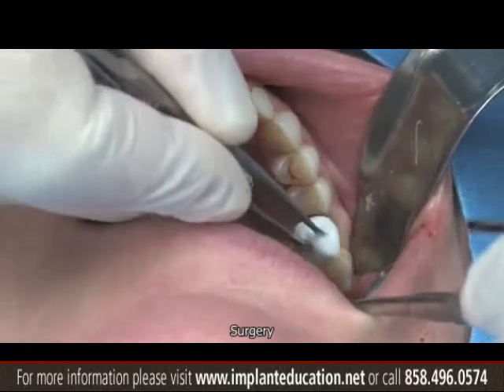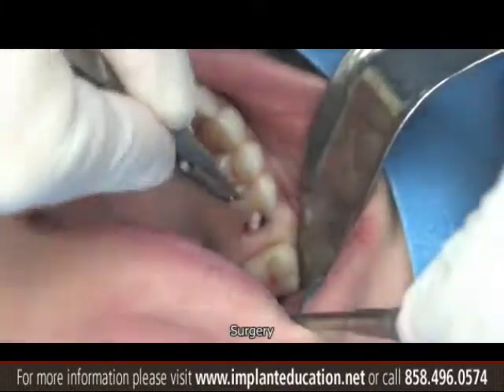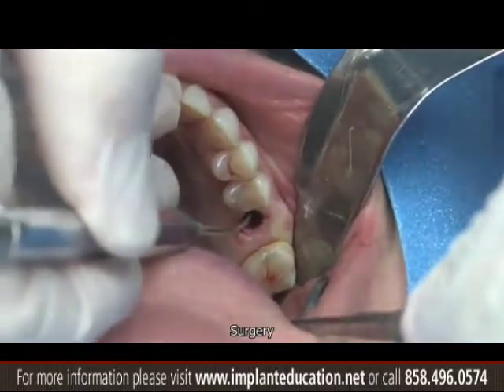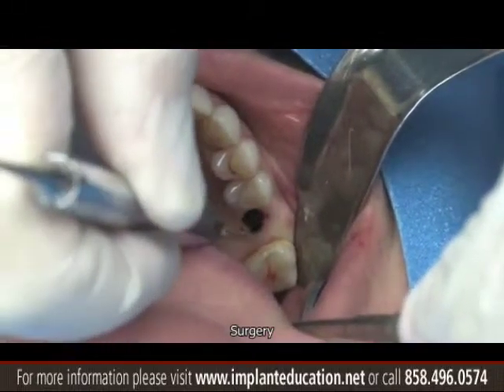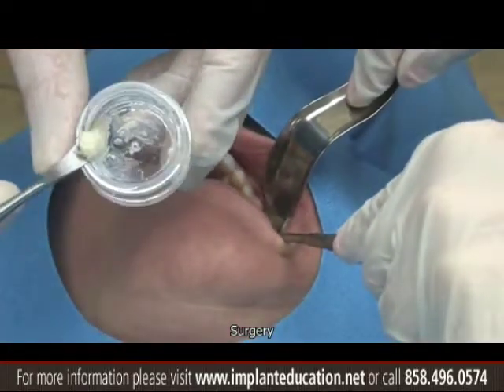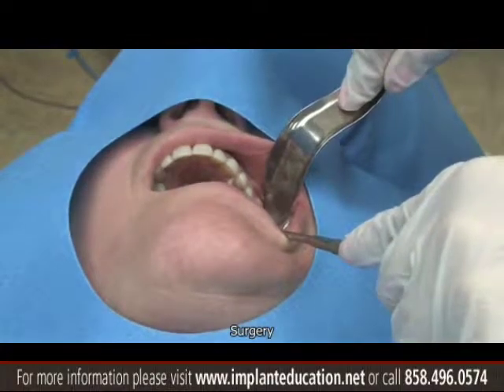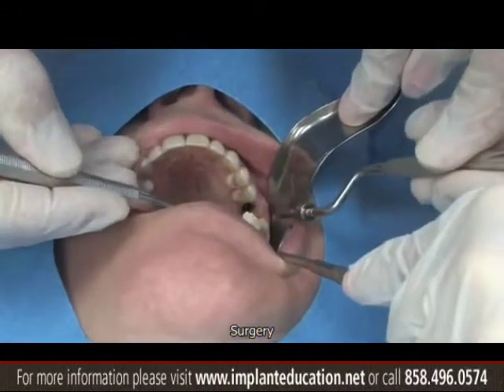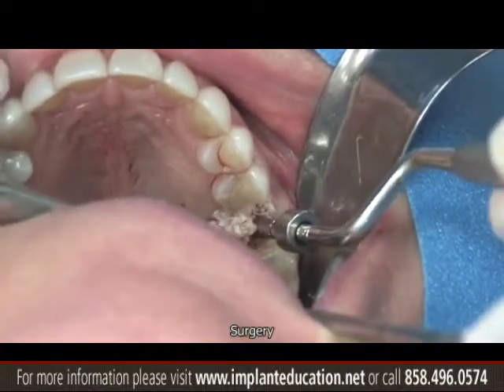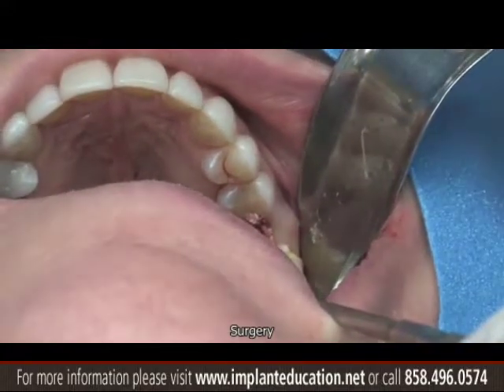So after the 2.0 drill, a couple of implant osteotomes, and then one sinus osteotome, we now introduce the collagen using two tools: smooth-tip pliers and the membrane placement instrument. We make sure the collagen plug did not stick to the walls of the osteotomy and push it gently all the way up. Now we introduce a little bit of bone graft material. Between the collagen and the bone graft, the osteotomy is completely filled.